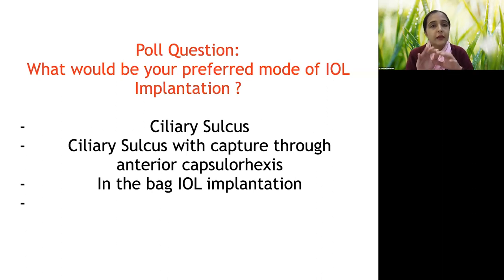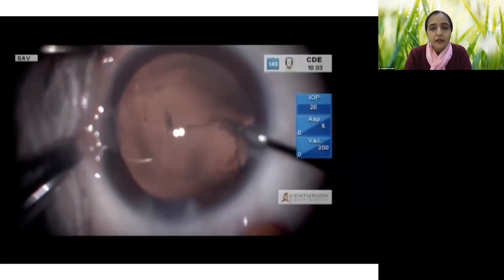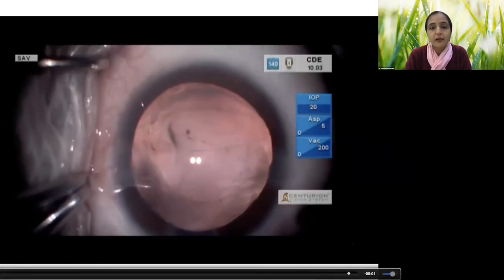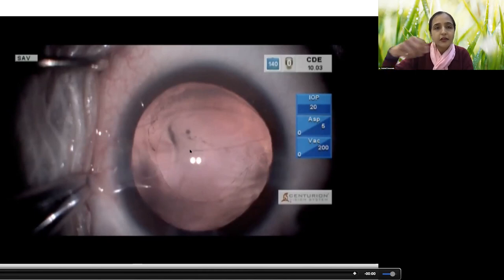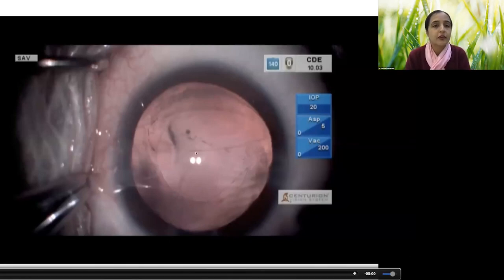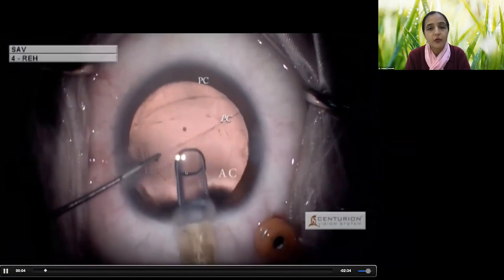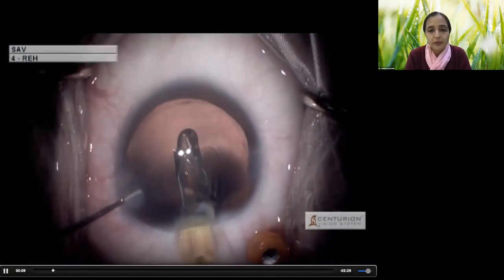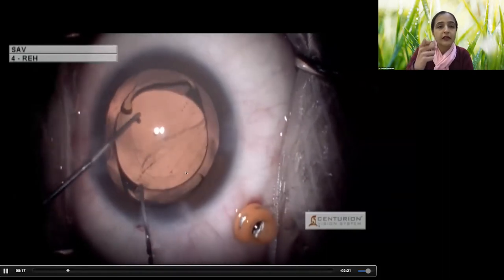Most surgeons would do a ciliary sulcus implantation or place the IOL in the sulcus and capture the optic through the anterior capsulorhexis. There is also the option of doing a posterior capsulorhexis in this situation. Using micro-incision forceps, I'm pulling the margins of this tear — it's a rough edge — to try to convert it into a strong posterior capsulorhexis. Fortunately, we could manage to create a strong margin on both sides, and a single-piece hydrophobic acrylic toric IOL is being implanted.